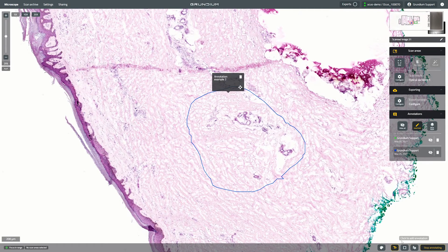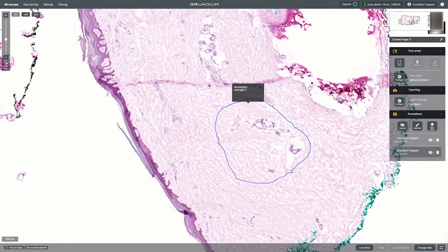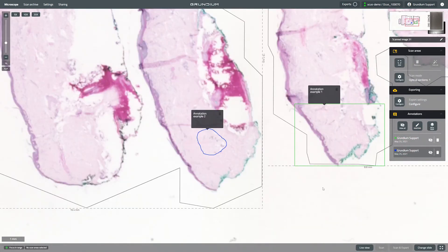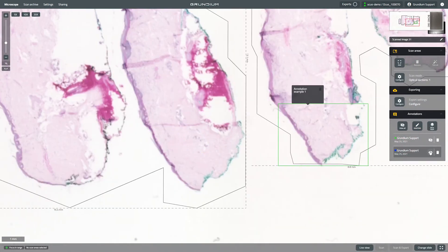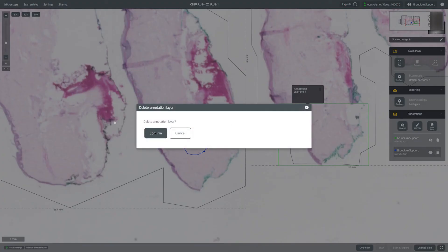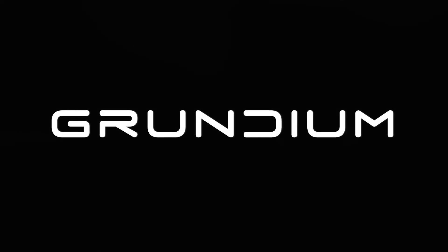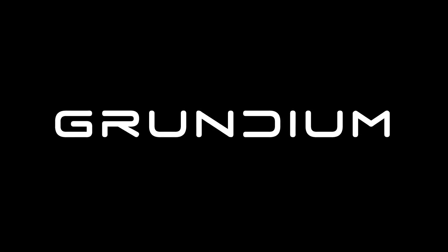When done, click Stop Annotation. You can hide annotation layers from view by clicking the visibility icon. Delete a layer by clicking on the trashcan icon and confirm.